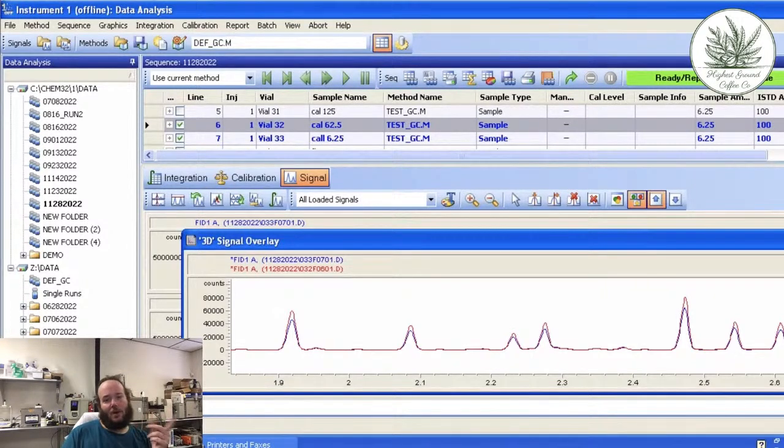I'll do the 10x. But what I'm wondering right now, so when I do the standards, I put them into little vials with inserts, which I don't have one in front of me to show you, but I'm fairly certain I did at least the half dilution correctly the last time, and I'm wondering, did it not vortex mix correctly in the insert vial?